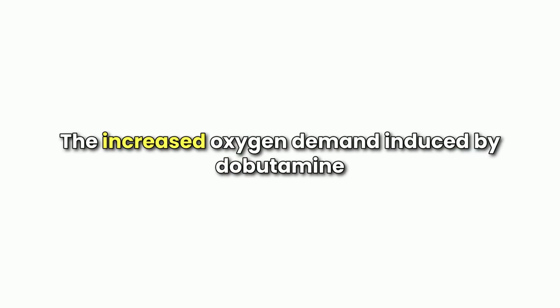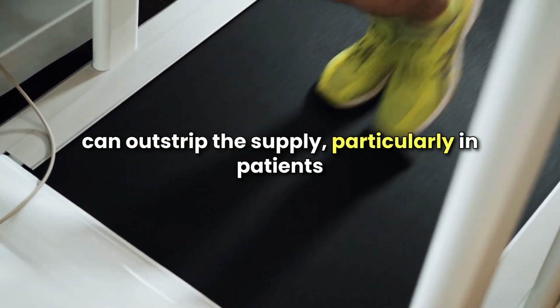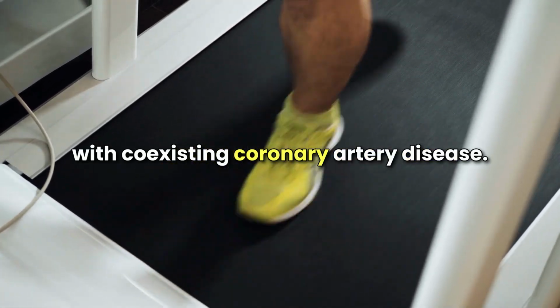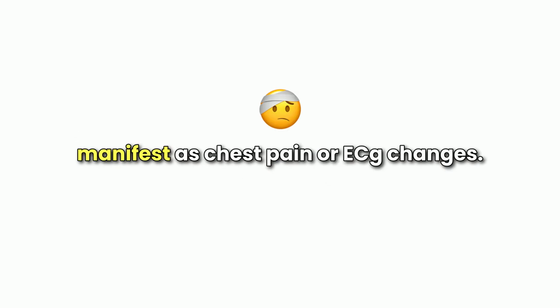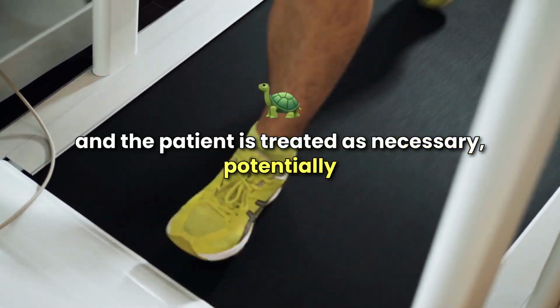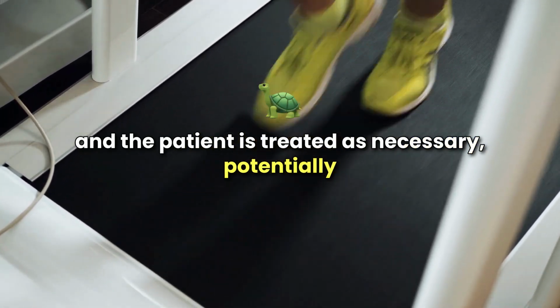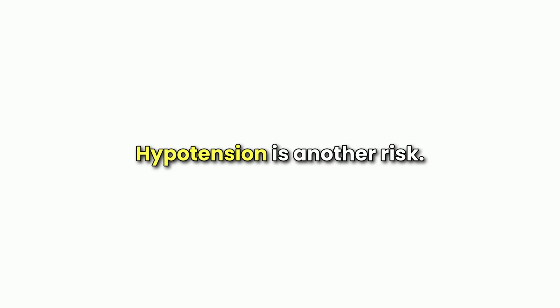Myocardial ischemia can occur during DSE. The increased oxygen demand induced by dobutamine can outstrip the supply, particularly in patients with coexisting coronary artery disease. This can result in myocardial ischemia, which may manifest as chest pain or ECG changes. If ischemia occurs, the test is typically terminated and the patient is treated as necessary, potentially with anti-anginal medications or further cardiac evaluation.